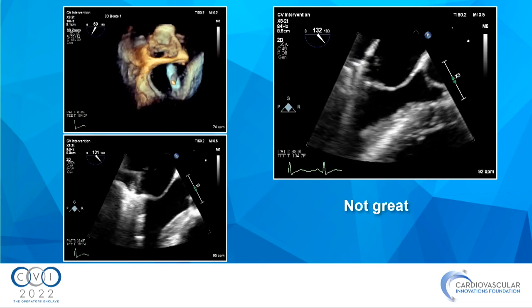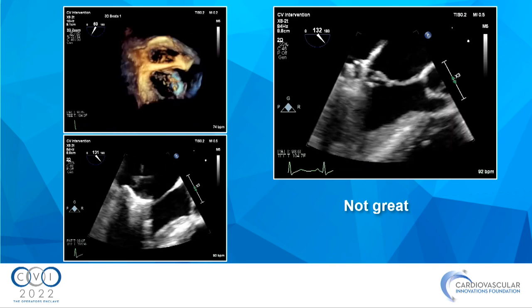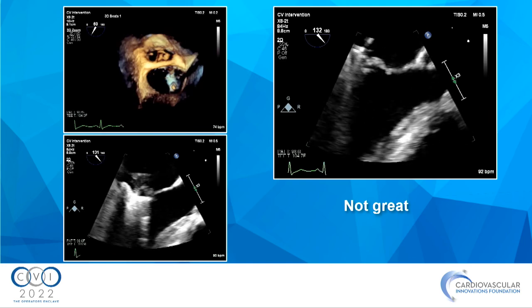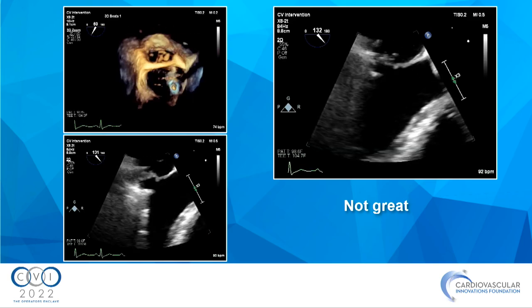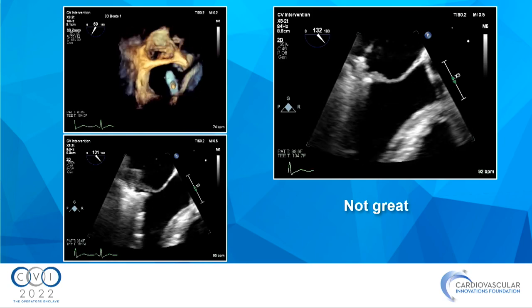Paul, one of the issues with these are such different planes, such different heights, so do you ever catch the posterior first and then drive down? So that was the big problem here. You look at this grasp, and I don't think any of us would be happy with it. When we think about a Barlow's valve with a tall gap height, we struggle with getting the arms on the LV side and the grippers on the LA side. But this gap height was extraordinary, because this is like a leaflet that was just simply billowing up and down. So I had a really hard time staying on the LV side and getting the grippers to fall in the LA. This is the only grasp I could get.